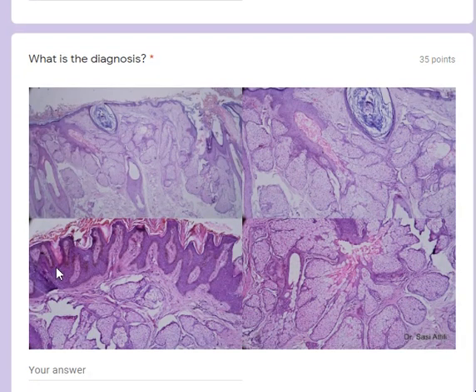Histology actually shows epidermal papillomatosis, acanthosis, with hyperkeratosis, you can see here. But what is prominent is these very mature sebaceous glands placed quite high in the epidermis. So normally, sebaceous gland should open into a hair follicle. But you can see that these sebaceous glands are opening directly onto the surface. And this is a typical clue to nevus sebaceous.